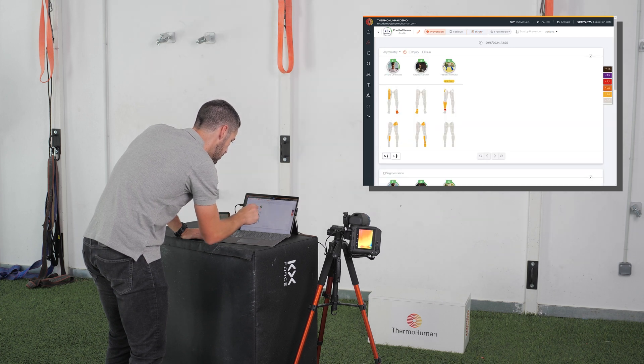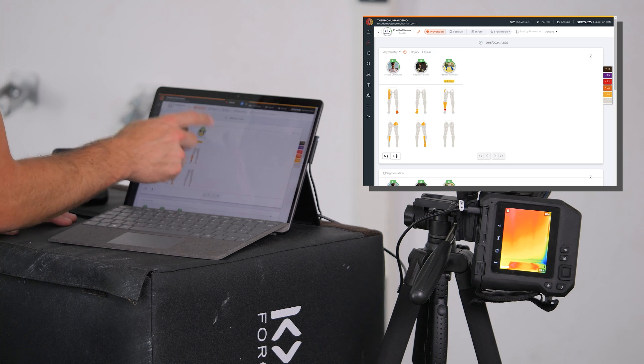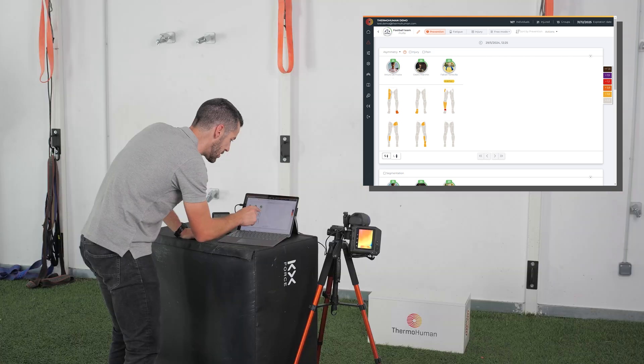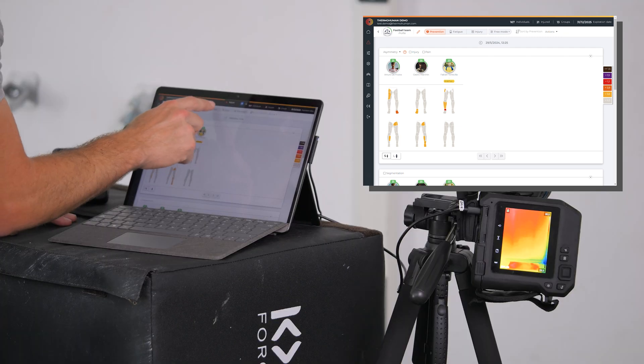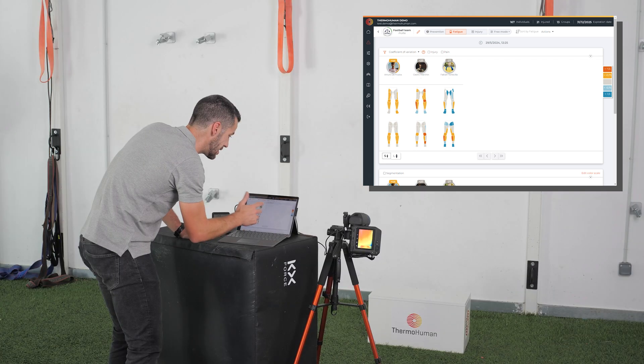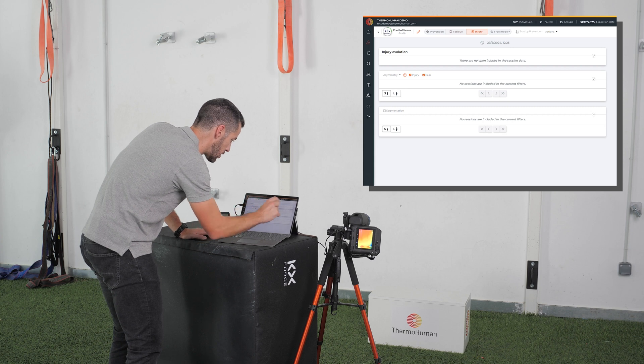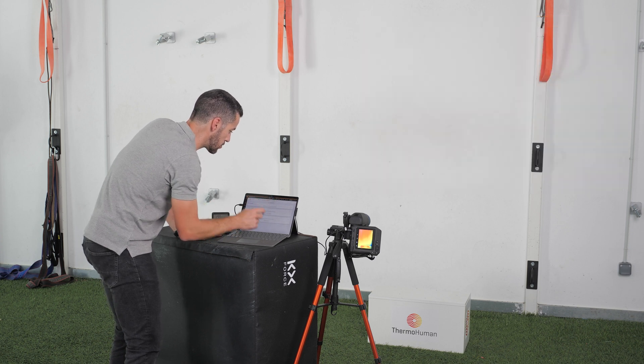If you click on Prevention, you will see results based on a general index called Tree, ranking players with fewer or more asymmetries and generating alarms — for example, an ankle alert on the right ankle. If we want to analyze fatigue, we get different results based on tendency — players getting warmer or colder than normal. And in cases of injured players, we can visualize the charts of their evolution regarding return to play.